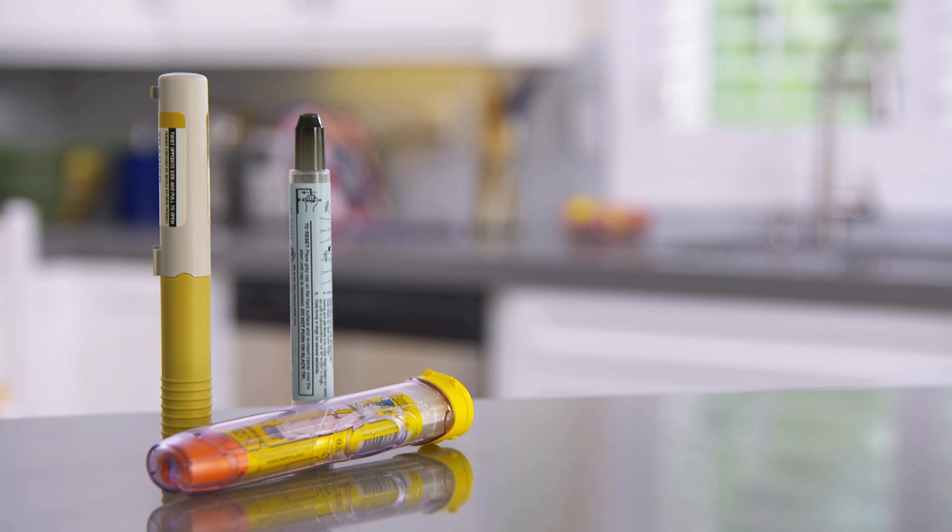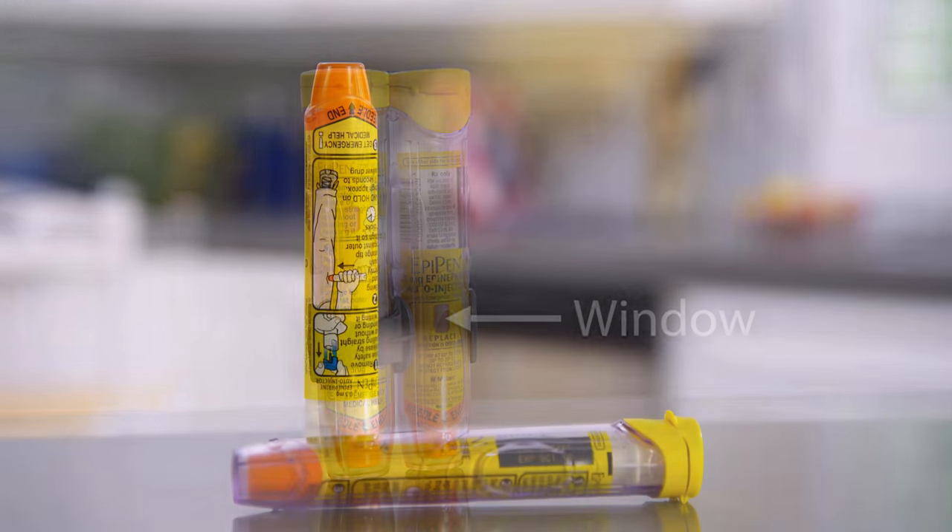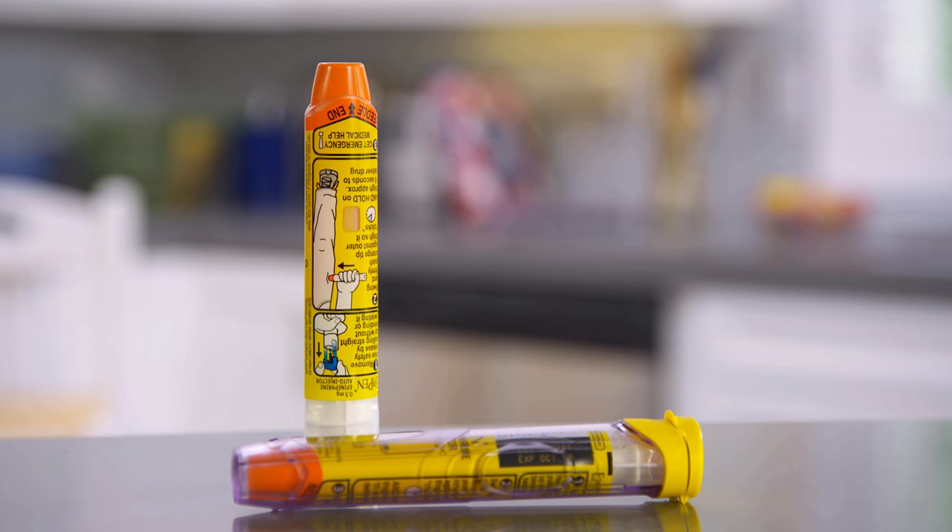There are several brands of epinephrine auto-injectors. Although they may look different, all of them work in about the same way. This auto-injector comes in a clear plastic case that protects it from damage. It has a window on its side so you can check the medicine from time to time. The medicine should look clear. If it's ever discolored or cloudy, you should throw the injector away and ask your doctor or pharmacist for a new one. You also should keep track of the medicine's expiration date. Be sure to ask for a new auto-injector if yours will expire soon.